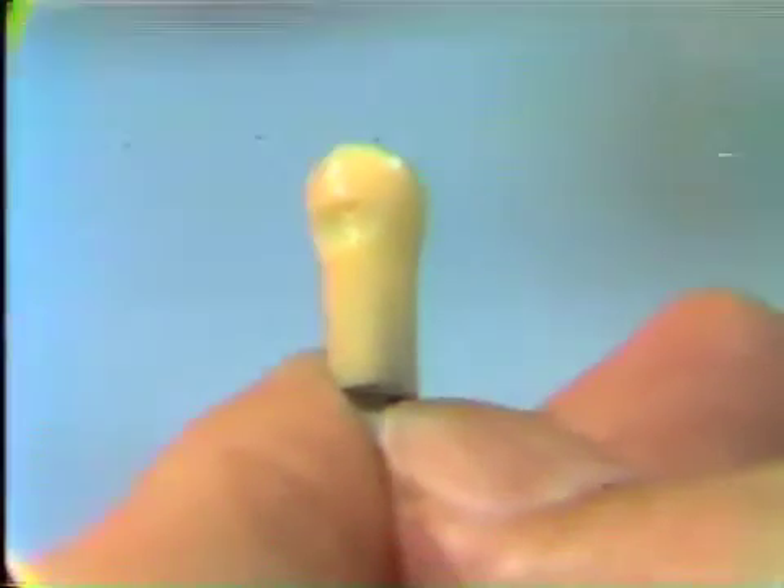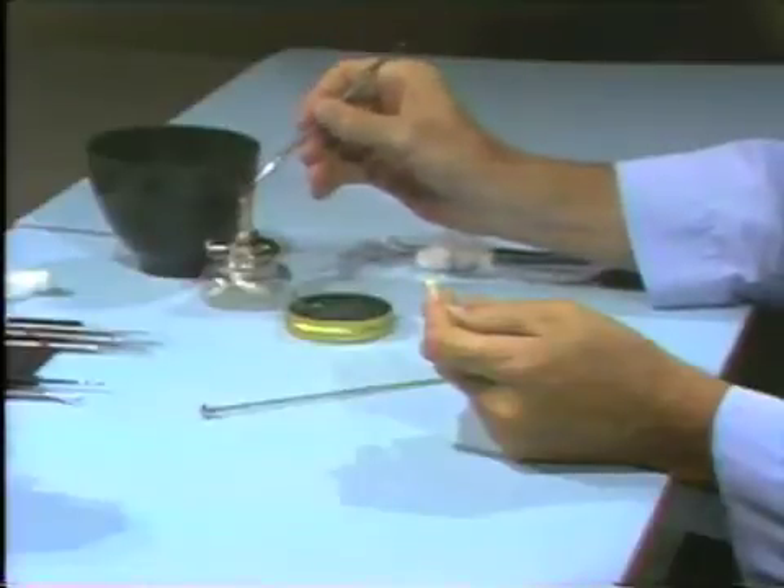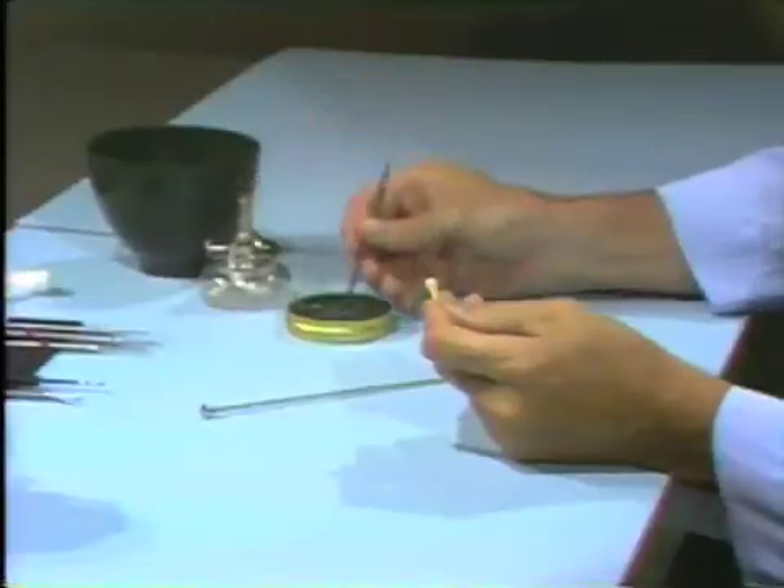I will begin the waxing and then we'll fade off and then show you the completed waxing and put it in place in the arch so that you can see how it should appear.